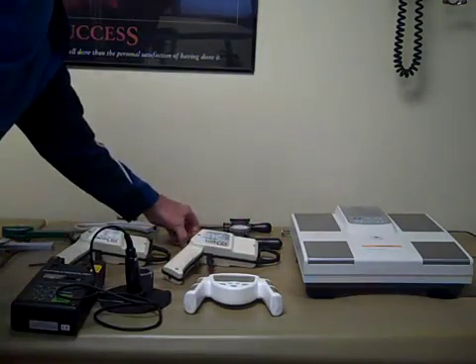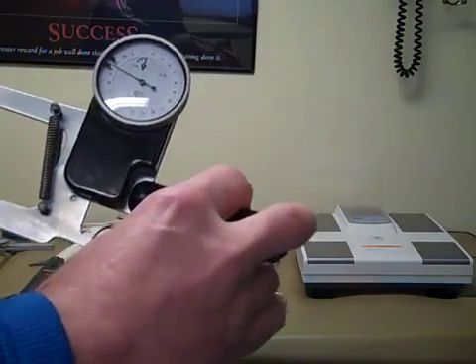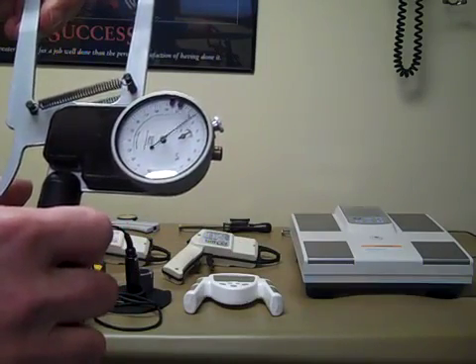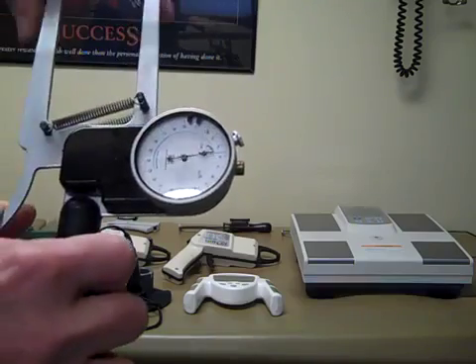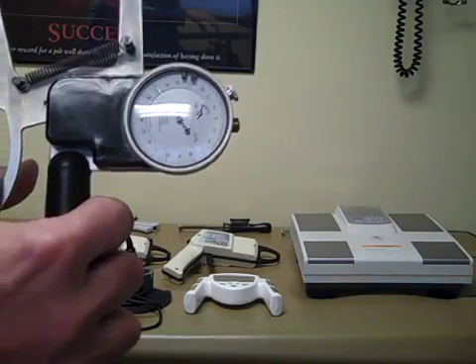Probably the industry standard would be the Harpenden calipers. These are probably the top of the line calipers. You can see the increments again are one millimeter, and the dial actually goes around two times. You can see the little small dial — it actually shows 20 and then 40.